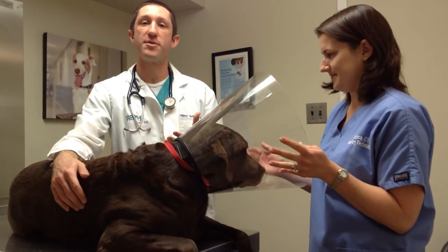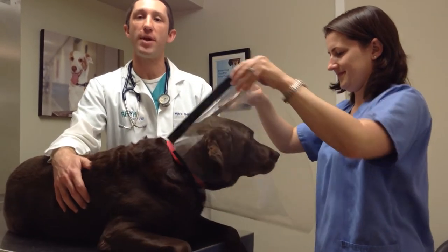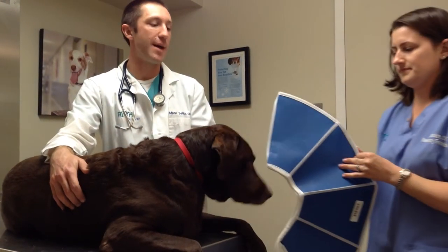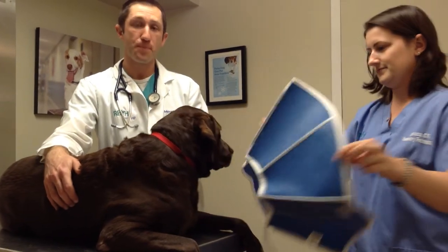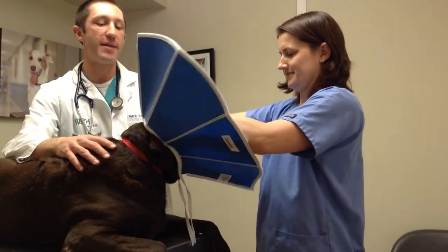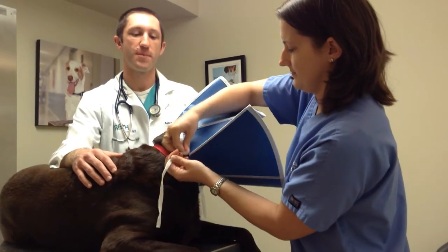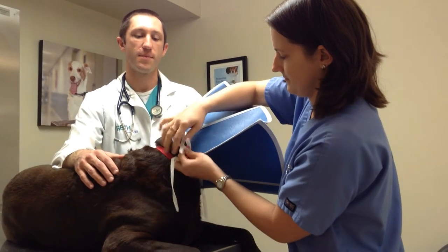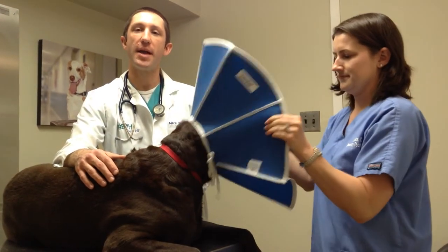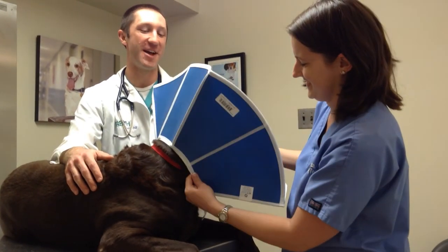That's why other manufacturers have come up with other designs. The second type is still a traditional cone shape, but it's soft. You can't see through this one, so sometimes animals don't like that. However, it's a lot more flexible and therefore sometimes better tolerated, especially when animals are walking around. Jess is going to apply this one the same way, and the same principles apply. This one ties into place, but again, the same rules apply — we want it loose enough to get a couple fingers in, but not so loose that it comes off. That one may have been a little too loose, so we'll be sure to tighten it next time.